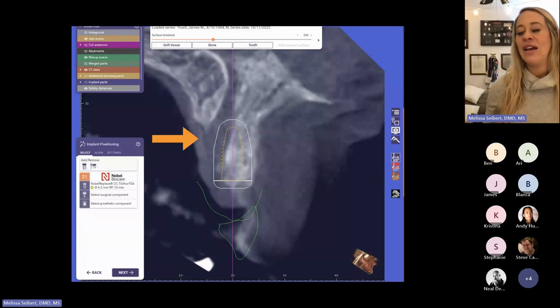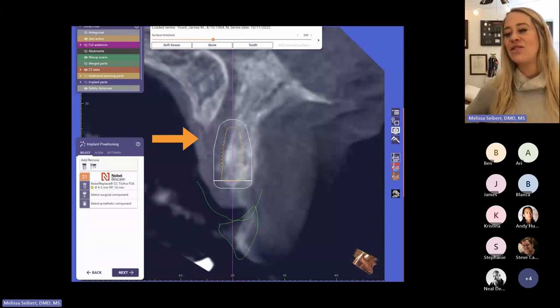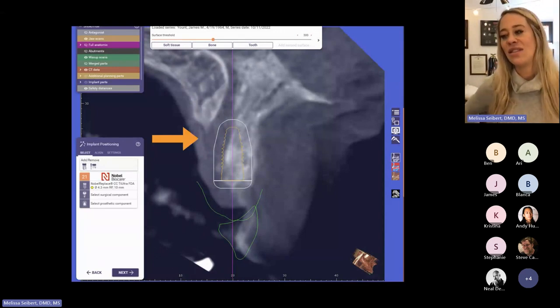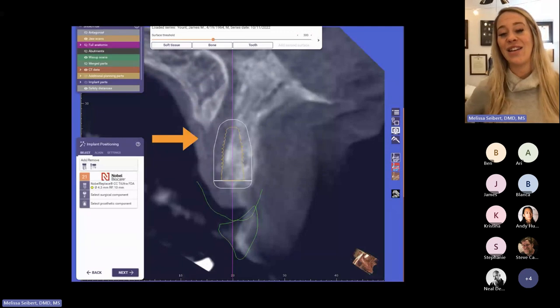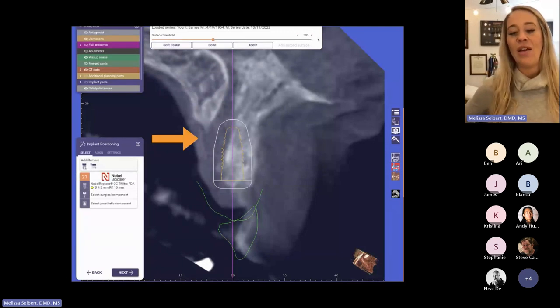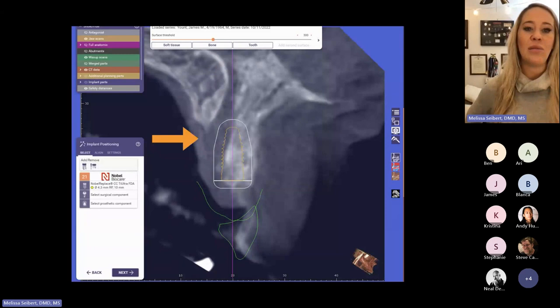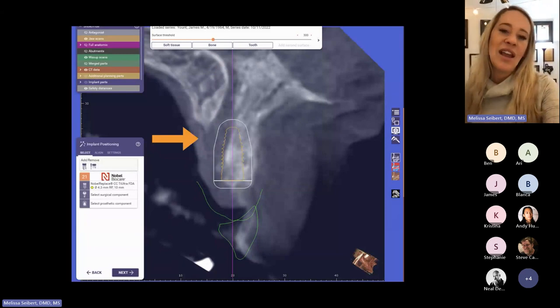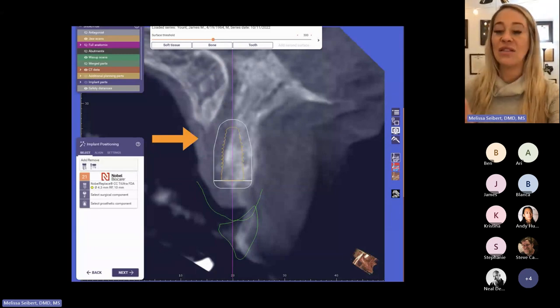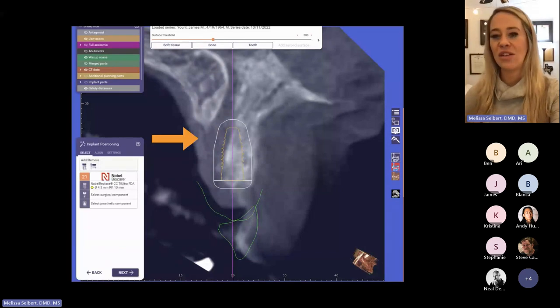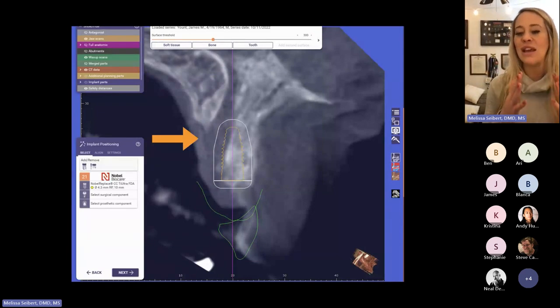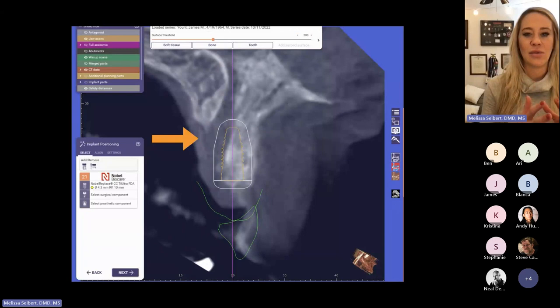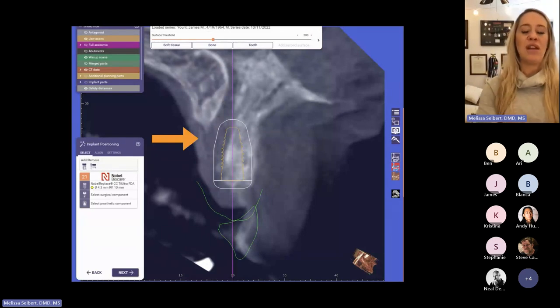The problem with Blue Sky Bio is that it doesn't really keep up with the implants. So oftentimes I have to plug in the dimensions of the implants manually — which if it's a routine tooth, that's not as much of a problem. But if I'm doing something in the anterior aesthetic zone, I need this to be dialed in and very predictable. So with ExoPlan, I selected a Nobel implant. And this speaks to communication and delivering value to your patients — I was able to show the patient that for the purpose of primary stability, I want this implant to be in as much good cortical bone as possible. Right now, we are impinging on the nasopalatine nerve and duct.